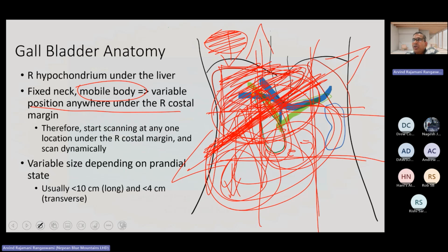So you keep the probe somewhere in the region of the liver, search for the liver, and identify the liver as a mixed echoic structure which has a lot of fluid-filled spaces. Where is it? I don't think I have a picture of the liver on ultrasound itself. I'm sorry. But it is super easy to get the liver.